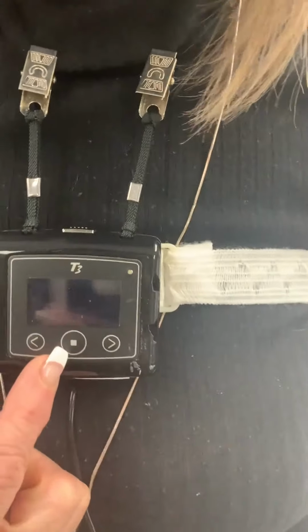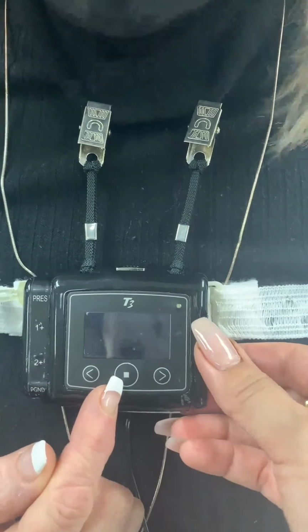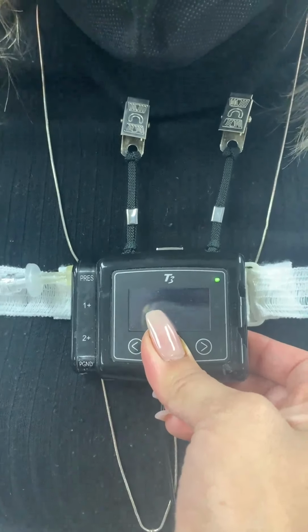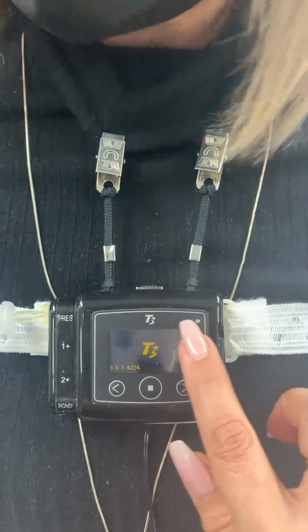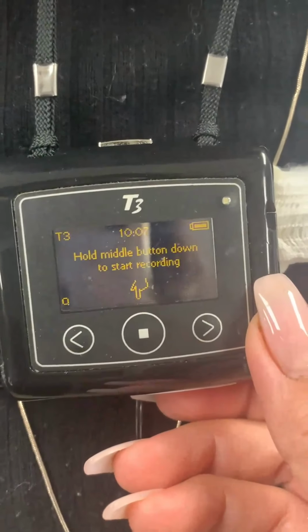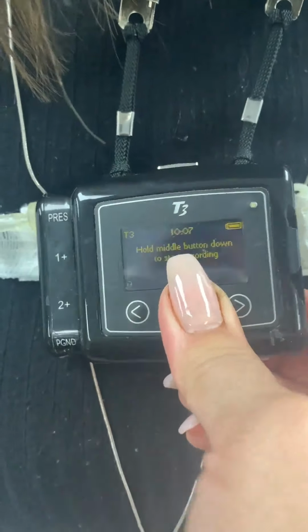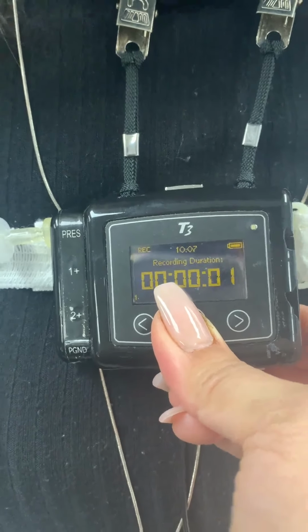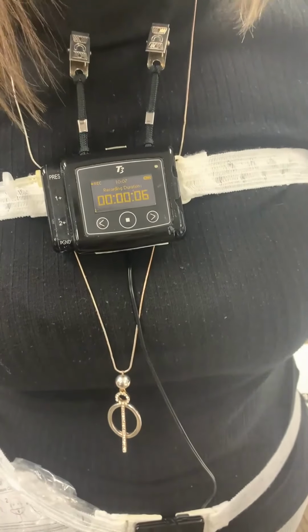The middle button is the only one that you will be concerned about. Press it once, it will bring the green light on. It will bring a message that says hold middle button down and start recording. Hold it until you see the bar get solid, and when you see the number 2, let go. You now are ready to go to bed.